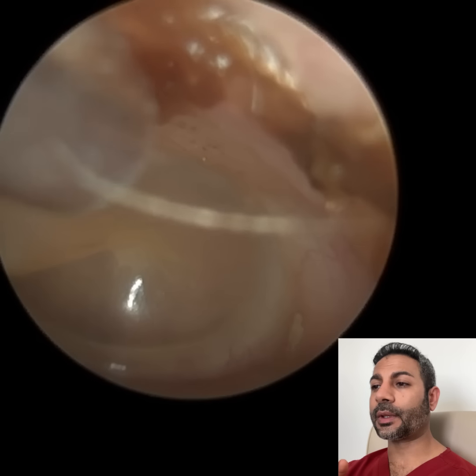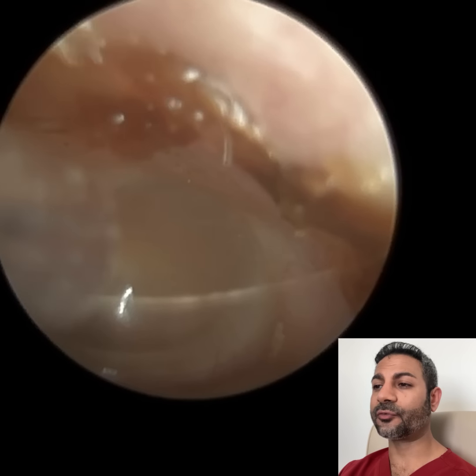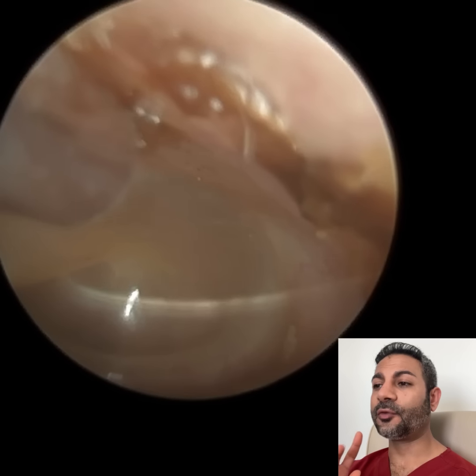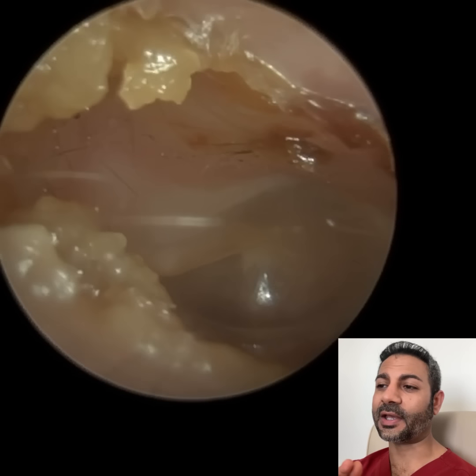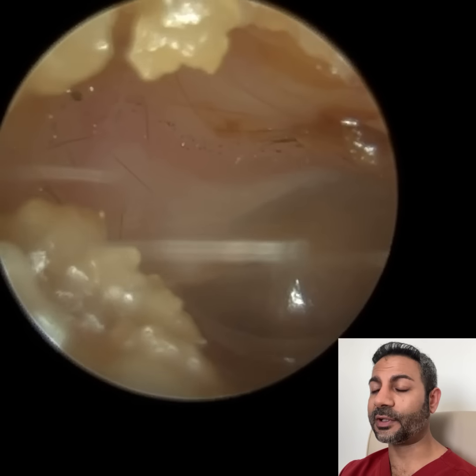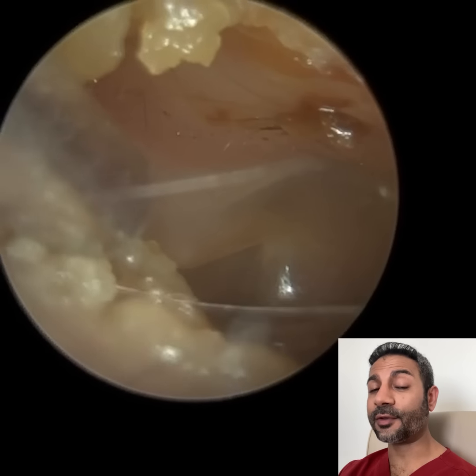But this patient, I don't think it was that. I think it was a very early stage external auditory canal cholesteatoma. Now, this is their left ear. You may have seen a few fungal spores there, and at the base of the ear canal where there's a little erosion, you'll see that erosion a bit better in a moment. There's a few hyphae there.